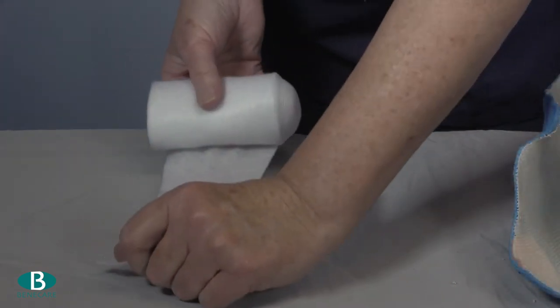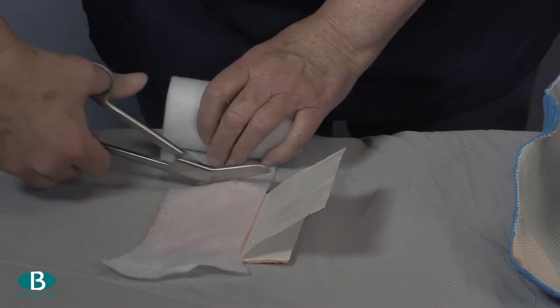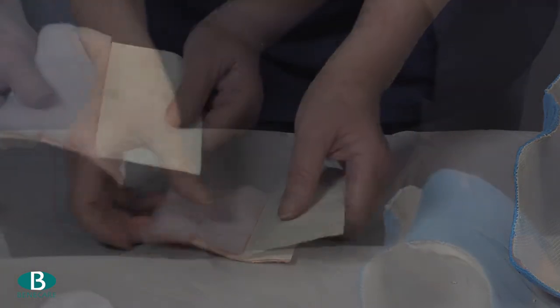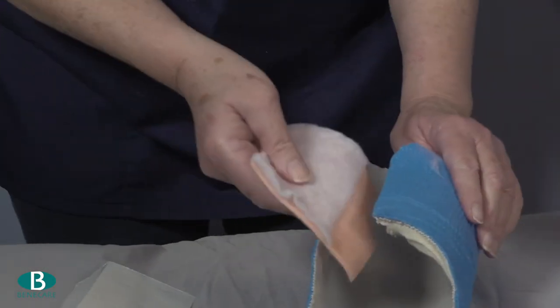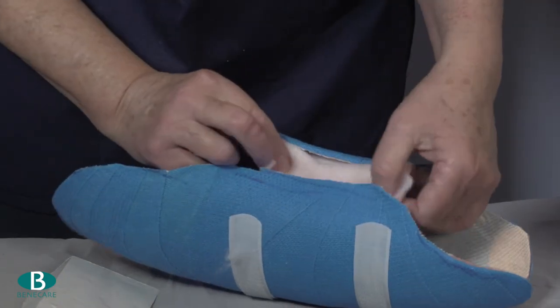To prevent pressure from the edge of the brace, make a tongue: cut a piece of fleecy web the same length of the brace, stick a piece of undercast padding along two centimetres from the end, and stick that into the brace along the opening.